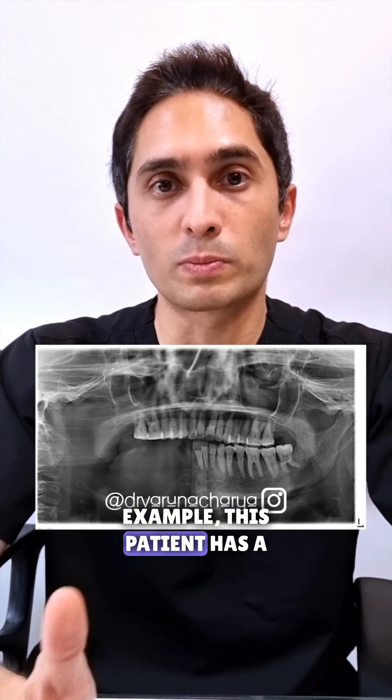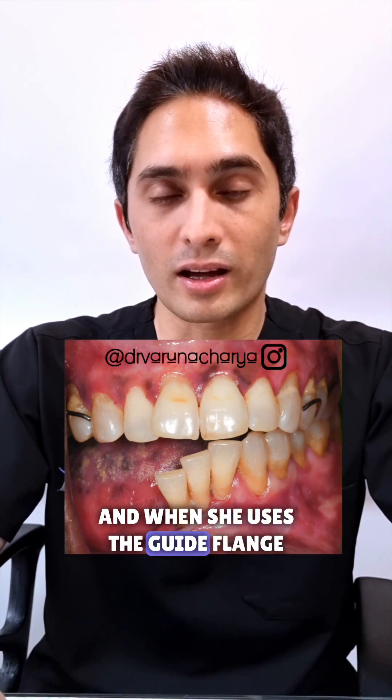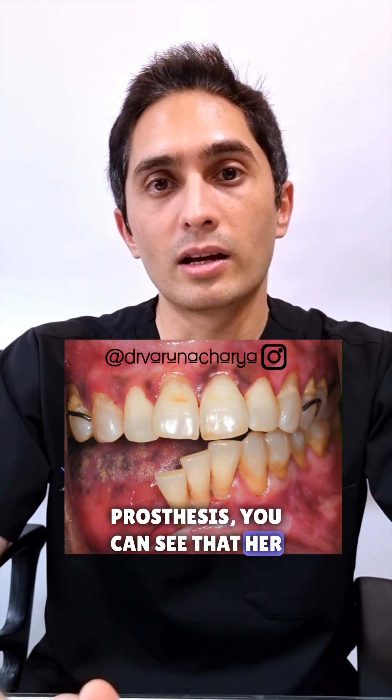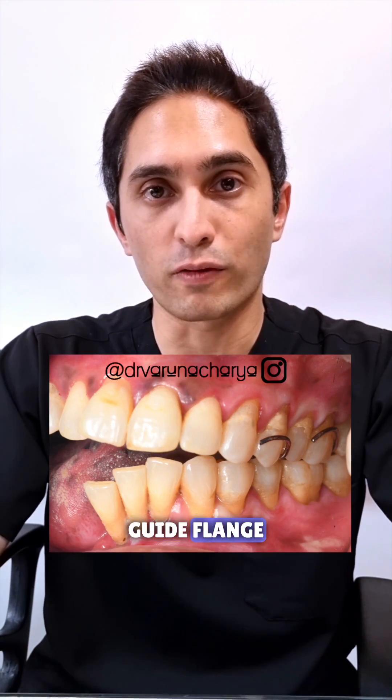You can see in this particular example this patient has a significant deviation to one side, and when she uses the guide flange prosthesis you can see that her occlusion is now re-established on the left side thanks to that guide flange.